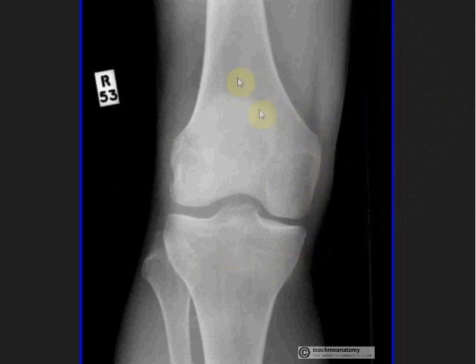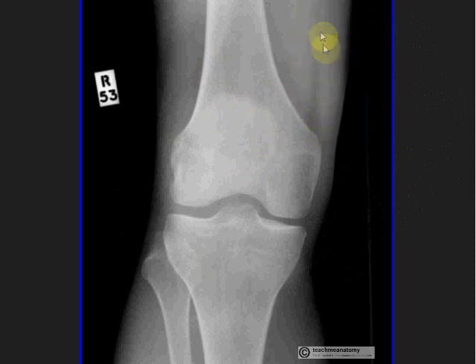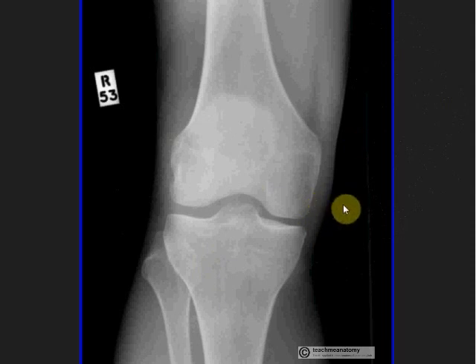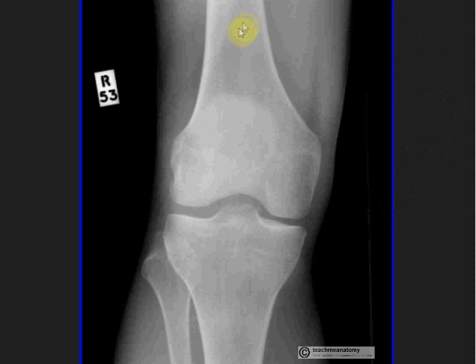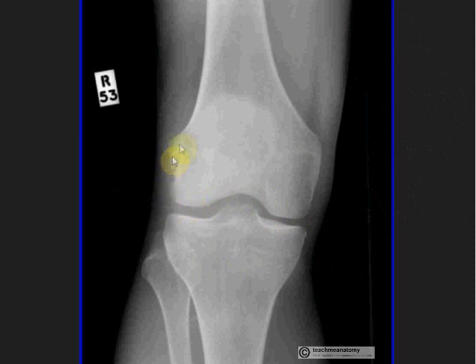So in this case, we have the white bone of the femur, the soft tissue around it in grey, and the black air. I would say this is a right AP X-ray of a knee, and then I would wish to follow around the bony cortex of the bones, looking for any interruptions that may show a fracture. It's a good trick — no matter how new to X-rays you are — just follow the border of the bone, and if there is a strange interruption in it, then it could perhaps be a fracture.